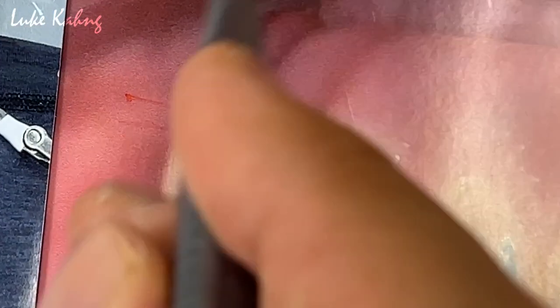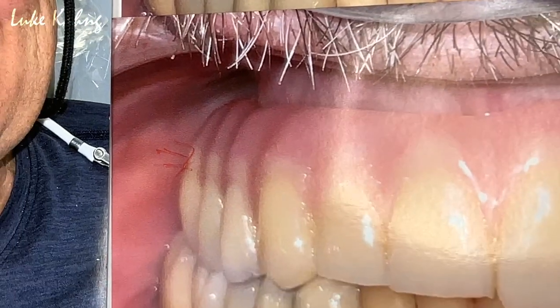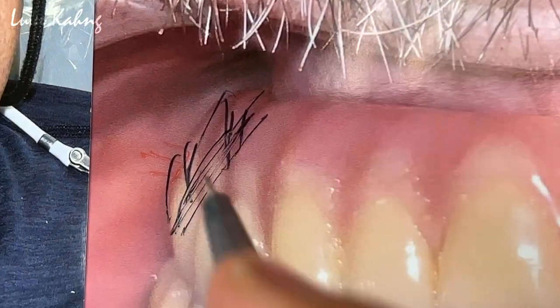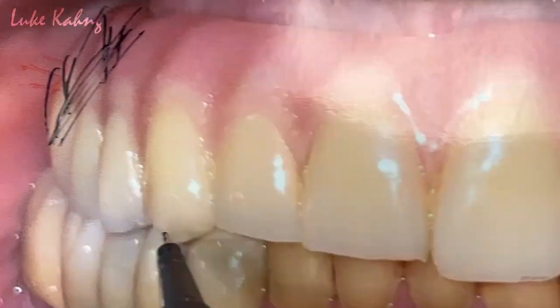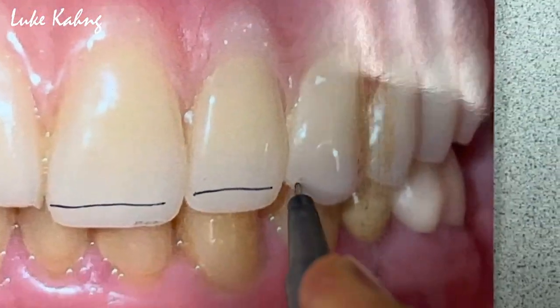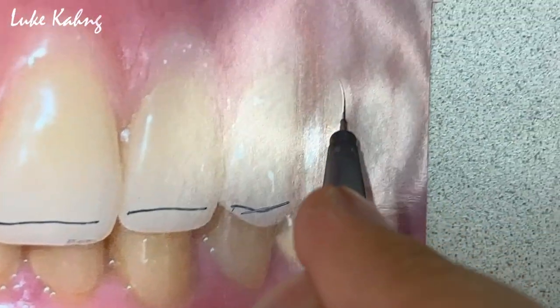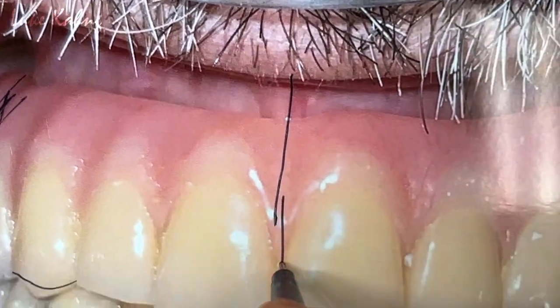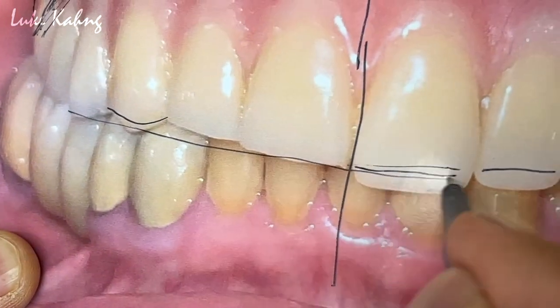Here is the issue to me. I have to trim here a little bit more instead of this. Just cut it a little bit, and here — which is what I already performed. Vocal contour a little bit there. The midline is still good. Make horizontal line.